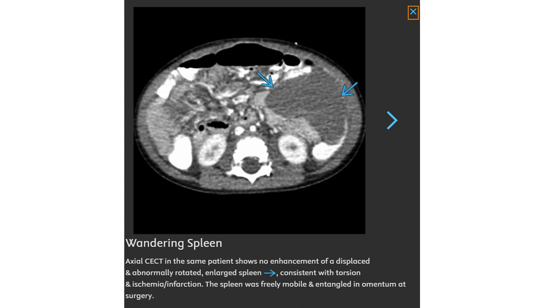Contrast-enhanced CT in the same patient shows no enhancement of the displaced and abnormally rotated, enlarged spleen, consistent with torsion and ischemic infarction. The spleen was found to be freely mobile and enlarged at surgery.